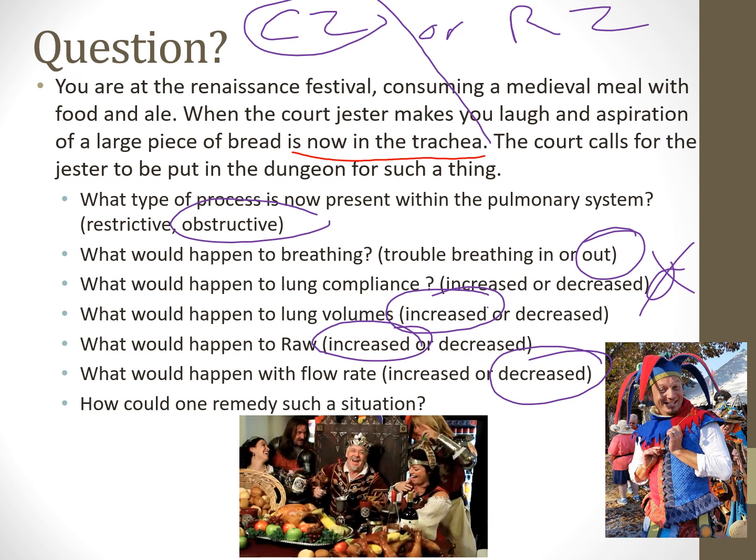So if you're a person that needs stories to help you remember these things, that's why I put these in there. So hopefully you can remember things that obstruct versus things that restrict, and you will have a better grasp of it. That's the whole plan, to get you better comfort with this material, so that you understand not only with pulmonary function testing what causes the numbers to go in the direction that they do, but also with things like mechanical ventilation, what happens with these things as well.